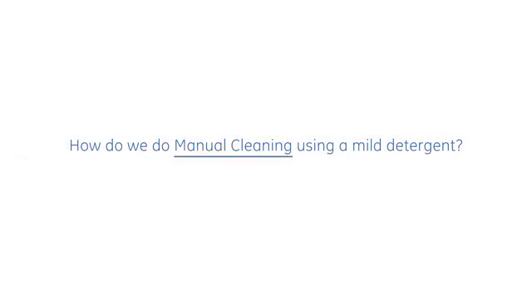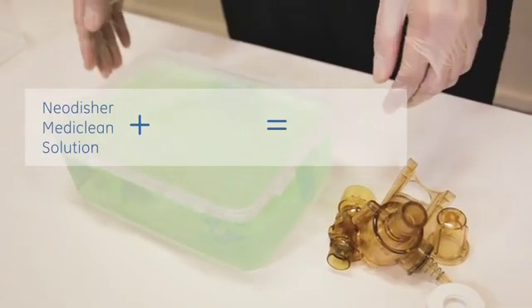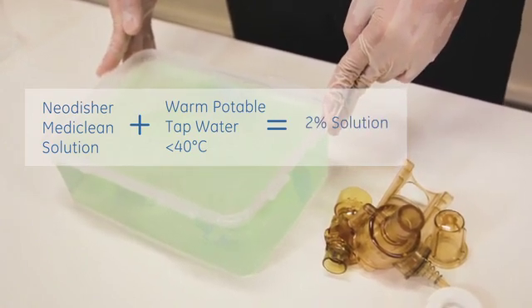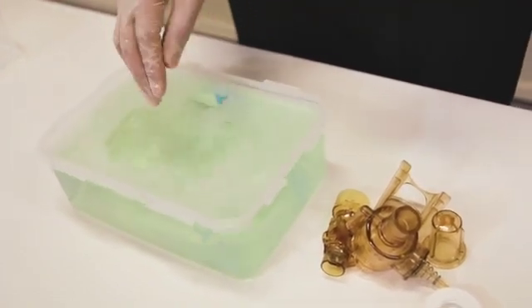So how do we do a manual cleaning using a mild detergent solution? First, we create a mild detergent solution by doing the following: dilute Neodisher MediClean solution with warm potable tap water less than 40 degrees to form a 2 percent solution. Create a homogenous solution by agitating the mixture.